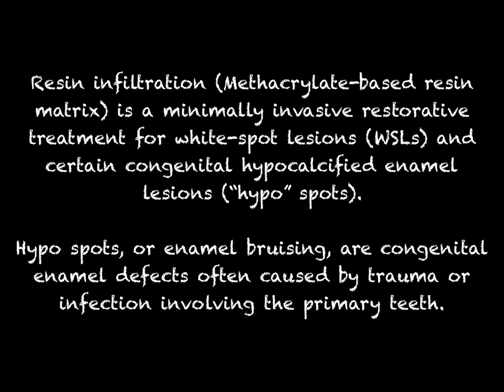This resin infiltration is a minimally invasive restorative treatment option for such white spot lesions. It can be used for all lesions which come to us as congenital hypocalcified enamel, hypospots, enamel bruisings, congenital enamel defects, which may be caused by trauma or some infection involving the primary teeth.